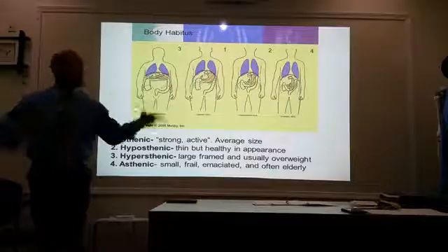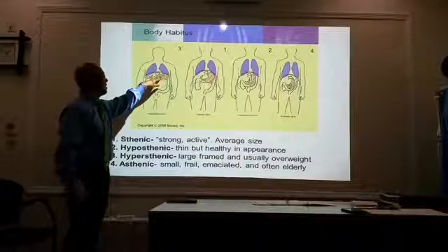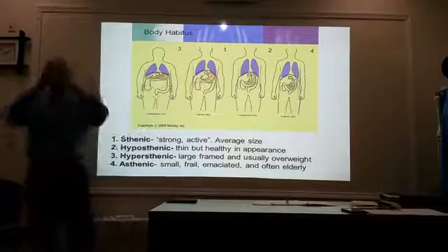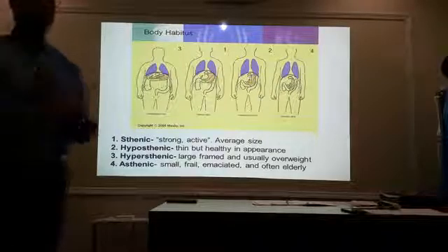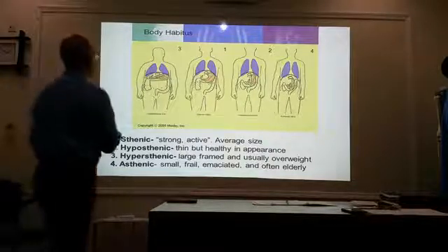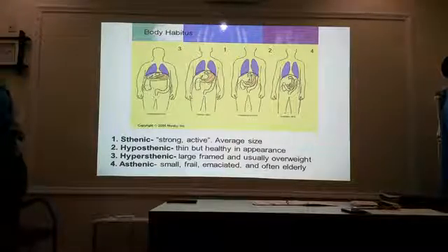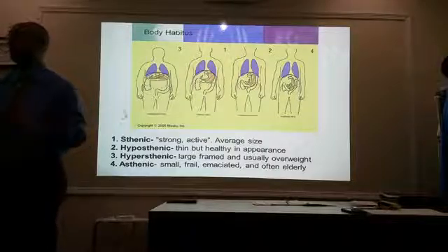Pushed up. The lungs become more square, the stomach is more transverse, the gallbladder is up here towards your lungs, but everything gets pushed up and to the side. You've got to be familiar with your patient's body when taking those x-rays. Okay? So that's body habitus. So not only are you going to be familiar with thickness, but body habitus is going to play an important part.